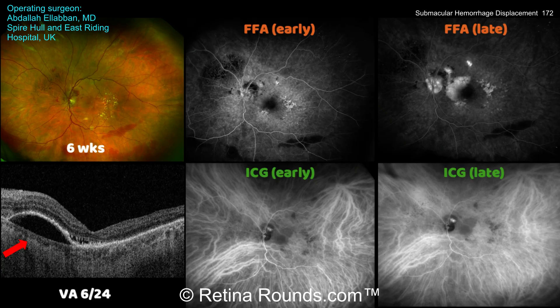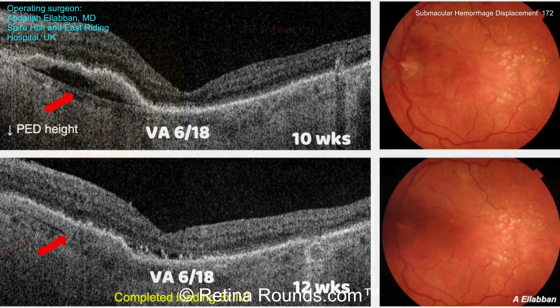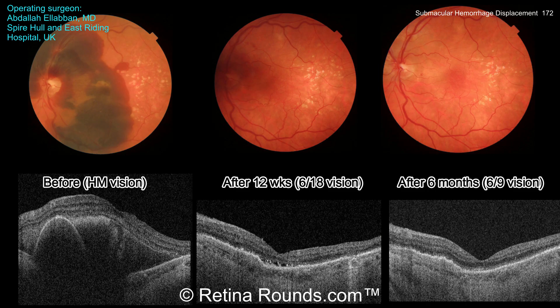Here's both fluorescein angiography and ICG angiography for this patient. In the early frames of the fluorescein angiogram, there's some window defect and leakage in the later frames. On the ICG, you can see small polyp-like lesions in the area of leakage that are present in the early stages and persist later, which is highly suggestive of polypoidal choroidal vasculopathy. At 10 and 12 weeks, the pigment epithelial detachment has largely settled down and the submacular hemorrhage has completely dissipated. From pre-op to 6 months after surgery, baseline vision of hand motion improved all the way up to approximately 20/30 with a tremendous restoration of normal anatomy in the macula.